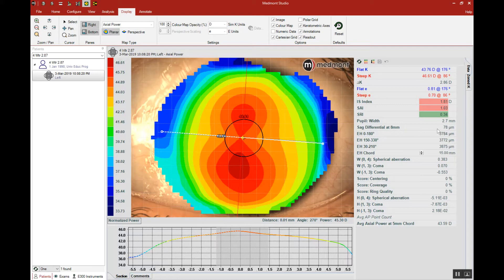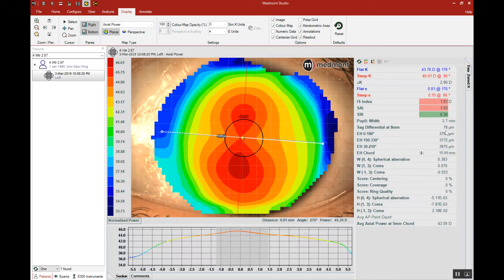Previous research has suggested that a toric lens may be called for at approximately 30 microns of sagittal differential. So this patient is well beyond that 30 micron threshold and one that's most likely to require a corneal GP toric lens.